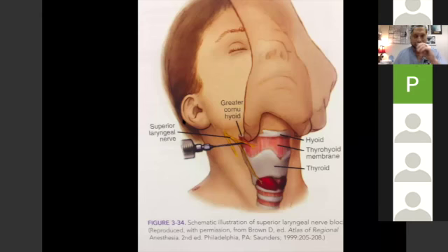But honestly, if you have a fibroscope, you just spray through the working channel when you see the cords. That's your best bet. But this might be for a technique where, let's say, you're going to do a wake look with a Glidescope. You might topicalize glossopharyngeal, like I taught you, and then do this external technique, so when you put the tube through the cords, they don't buck a lot.